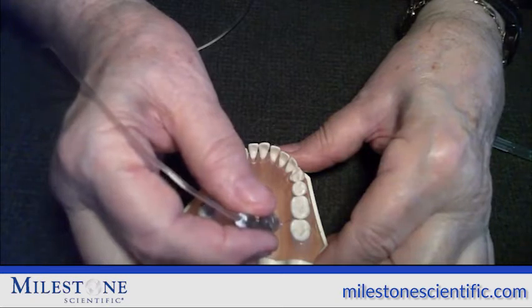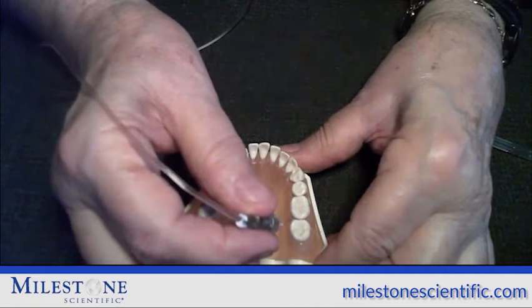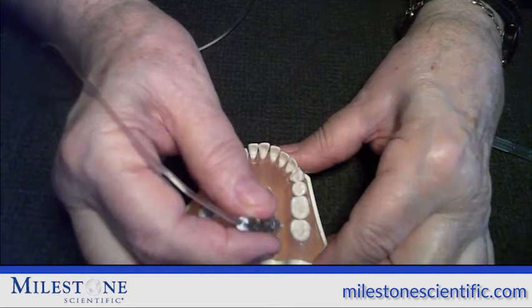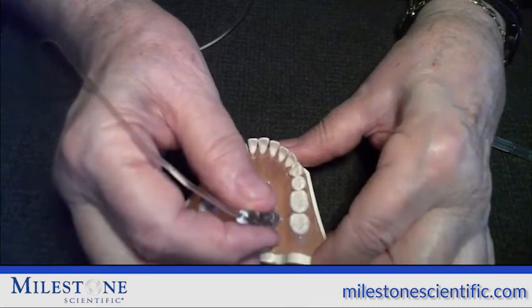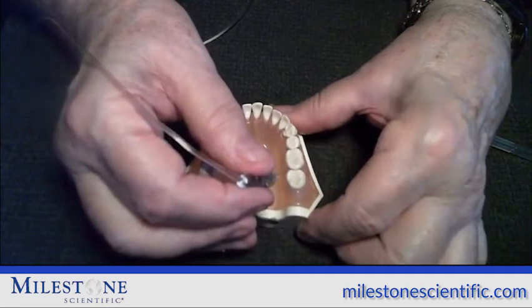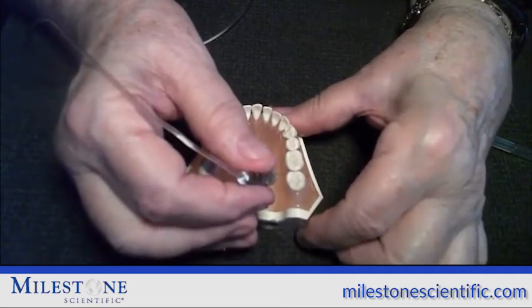You hold the needle in place and you deliver the amount that you want to give. And normally we recommend a half cartridge of lidocaine. And if you're using articaine, 1/4 of a cartridge of articaine. When you hear the sound of the instrument telling you how much anesthetic you've delivered, for example, 1/4, you hear beep, beep, and gong, that means 1/4. And beep, beep, gong, gong means a half. You need to pull out.